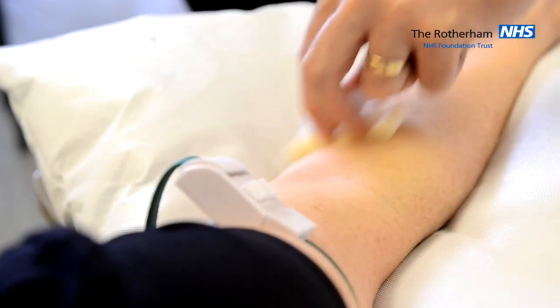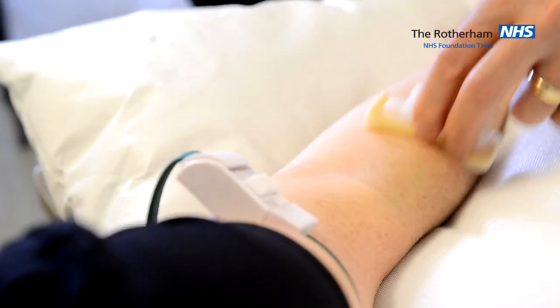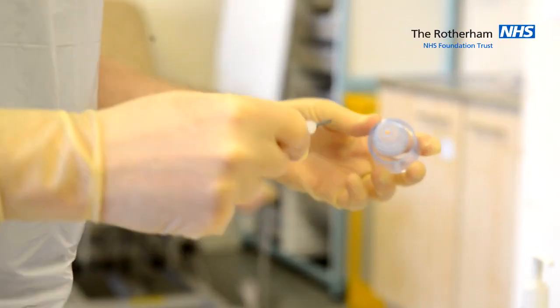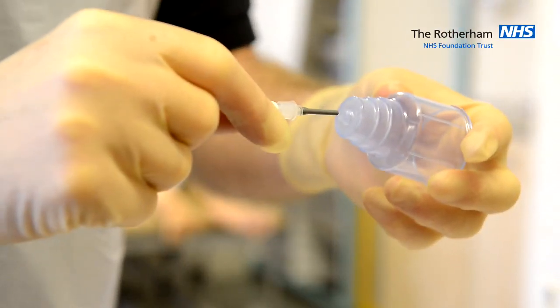Once 30 seconds is complete, we leave the solution to dry. We need to attach the adapter to the butterfly without contamination.